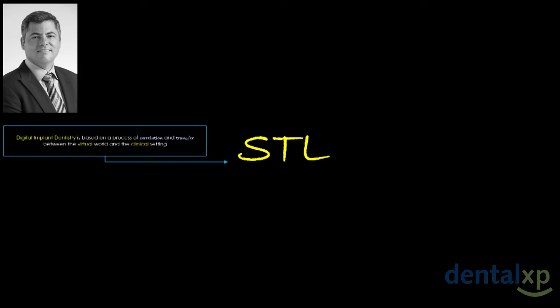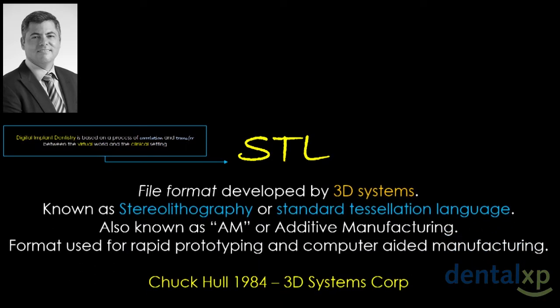So remember the original statement that digital implant dentistry is based on a process of correlation and transfer between the virtual world and the clinical setting. Keep it in mind, because that's, again, the end of the game.